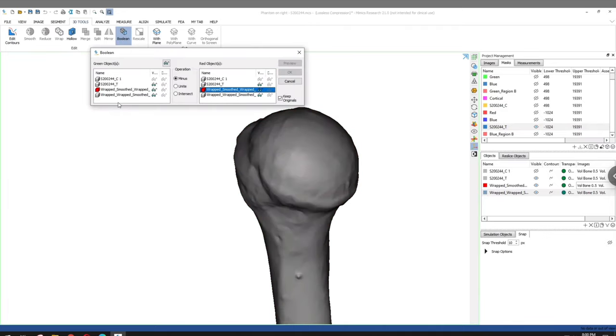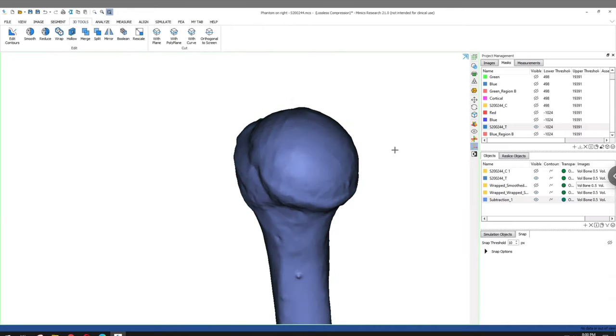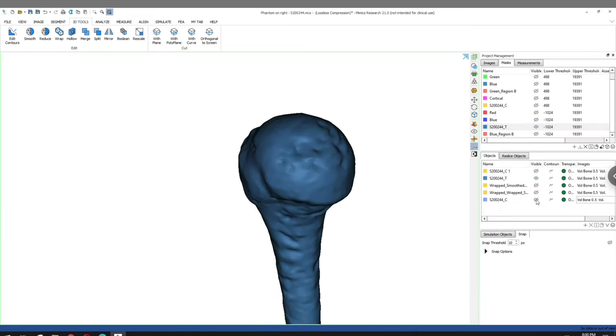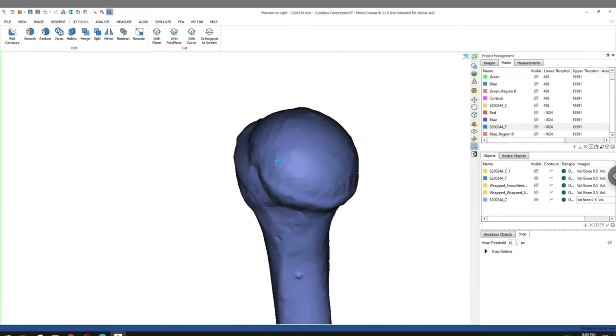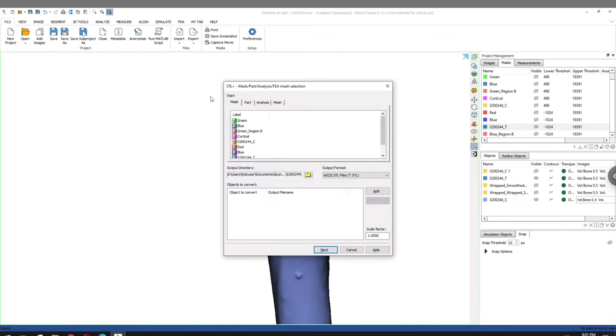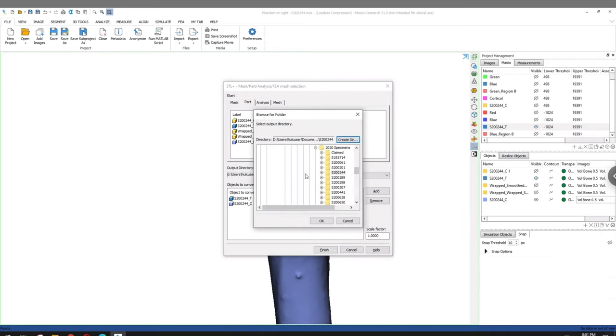Now, just performing another step to really ensure that there's no interference, I like to perform a Boolean subtraction, actually subtracting the cortical shell from my trabecular interior. Now, this ensures that you're not shrinking your trabecular inside really at all, and you're just making sure that there's no interference between the two parts. Now I'm relatively confident that this is an accurate and full part. So essentially right now, just make sure you save your work and export your documents.